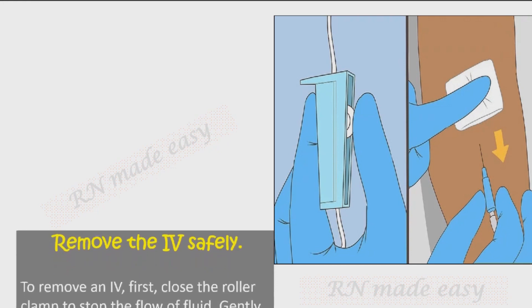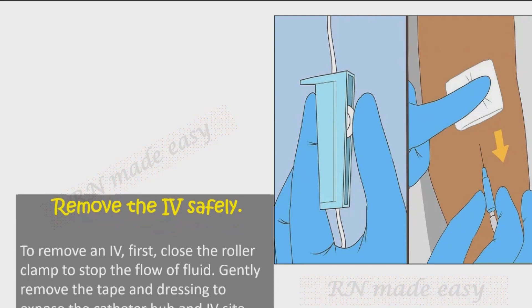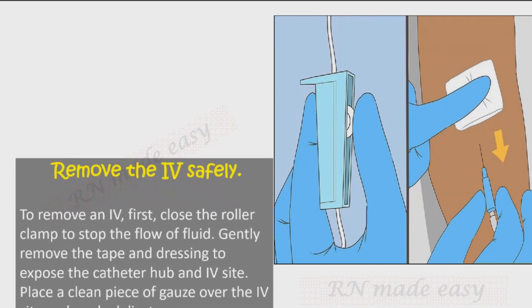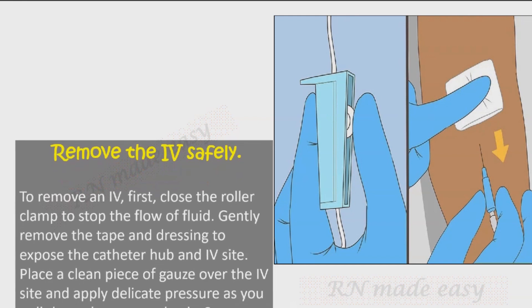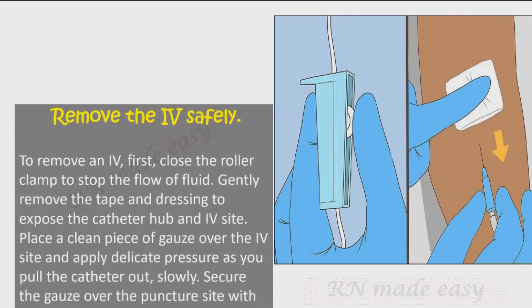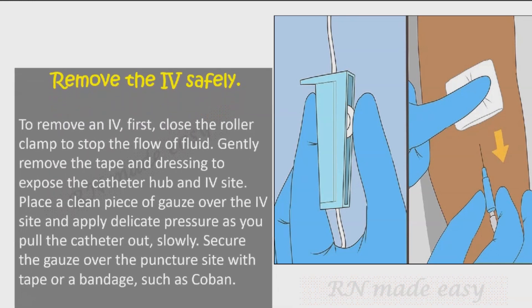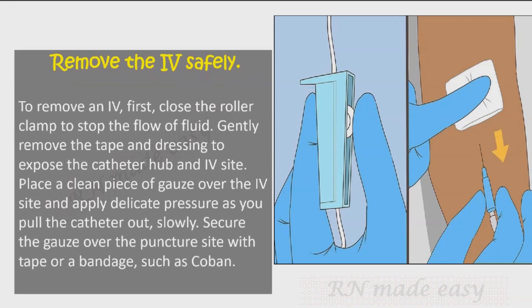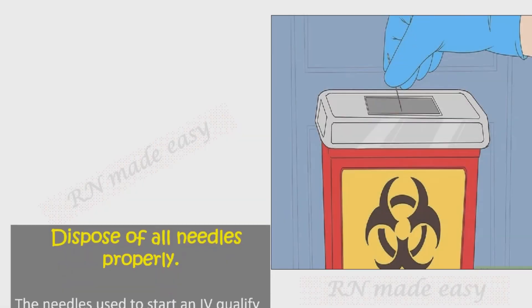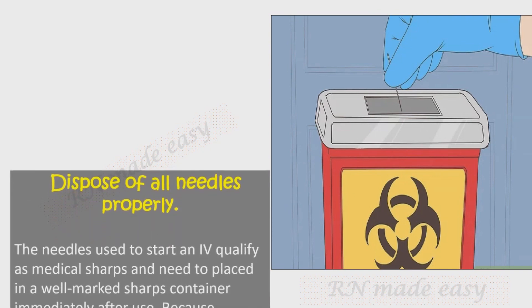To remove an IV, first close the roller clamp to stop the flow of fluid. Gently remove the tape and dressing to expose the catheter hub and IV site. Place a clean piece of gauze over the IV site and apply gentle pressure as you pull the catheter out slowly. Secure the gauze over the puncture site with tape or a bandage such as Coban.